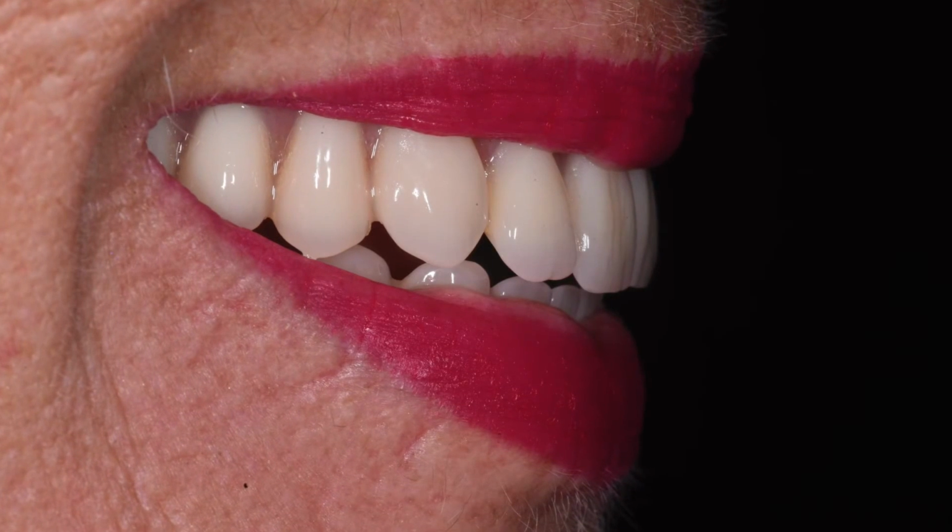Always go to 2 week check. So at this stage, you're really checking the oral hygiene. Patients have healed, as in their gums have healed completely, just waiting for the implants to take, which normally takes around about 3 months. Again, the profile shot.